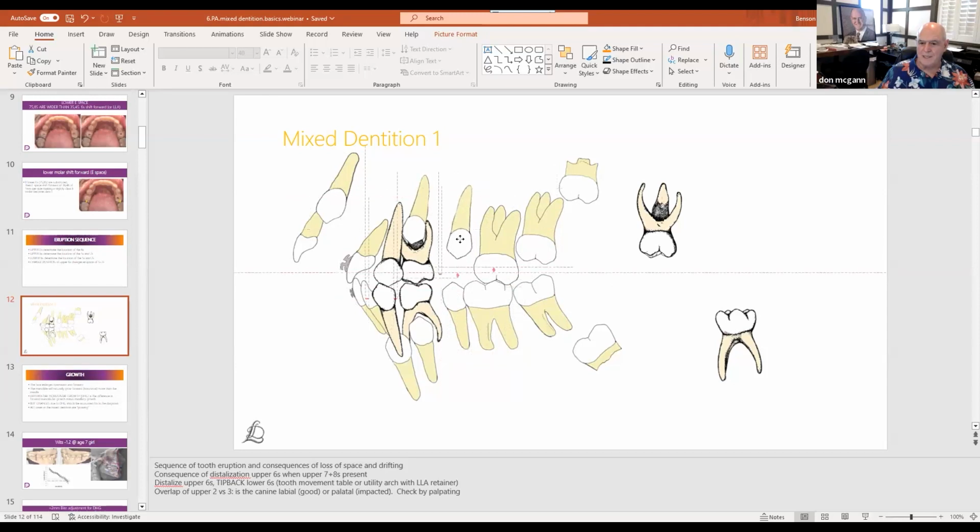Now, in the eruption sequence, let's get this in here. These are the last teeth out.